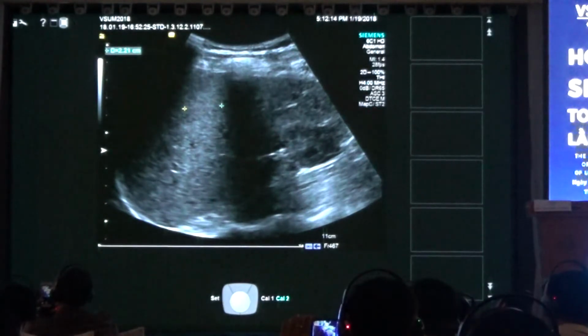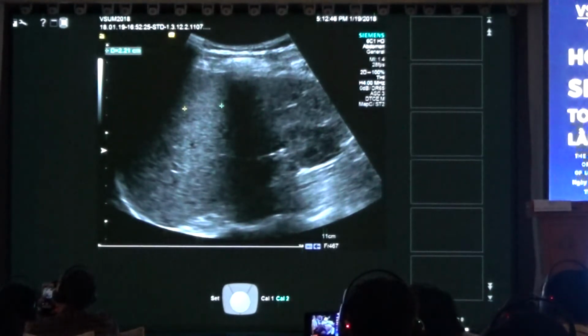And they keep their knees like it is here, and I have my elbow right on here to bring also this part of the body to widen the intercostal space to get a better window for the elastographic imaging. Okay, go a little bit like that. Okay. Right now we will have a look if our window has been better to make point shear wave elastography.